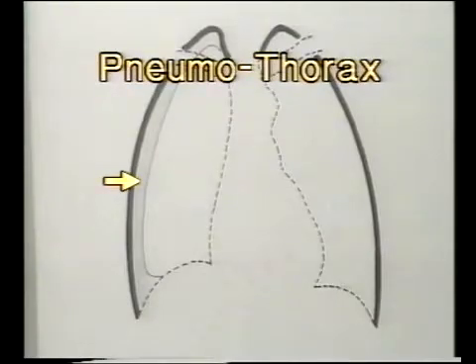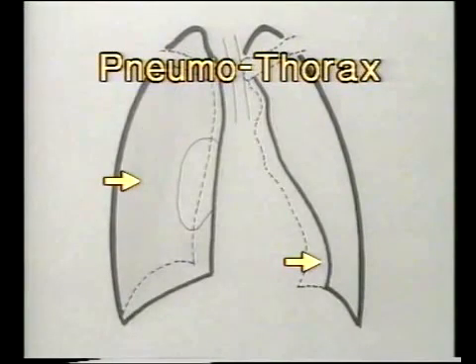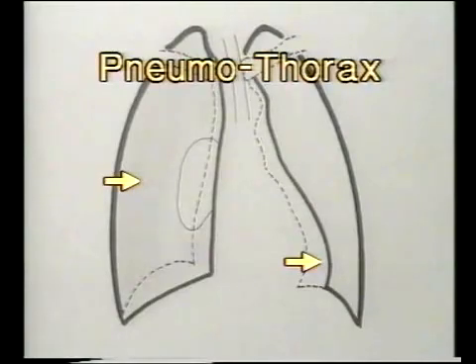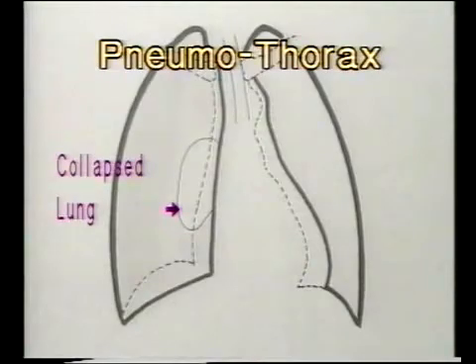When large, it produces a complete collapse of the lung and shift of mediastinum to the opposite side. Note the collapsed right lung which gets collected as a radio opaque shadow at the hilum in massive pneumothorax.